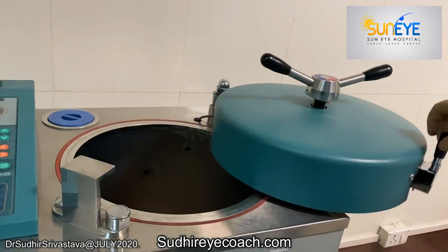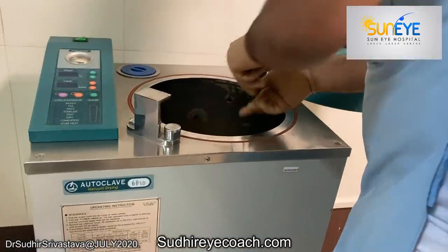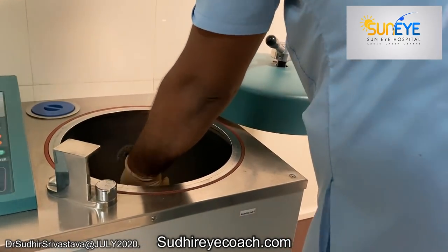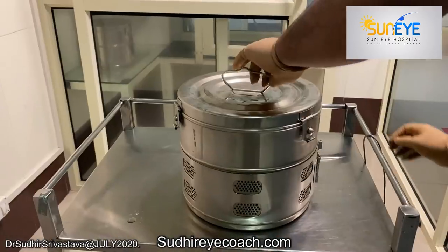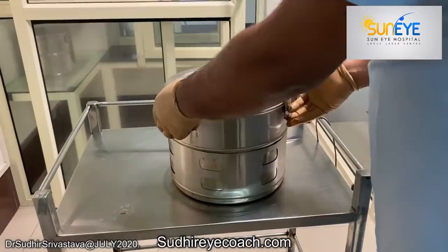It is very simple. Keep the daily Bowie-Dick test sheet at the bottom of the sterilizer and try to keep the level side up. It should be done daily, and we have to run a cycle of 130 to 134 degrees centigrade for a 5-minute cycle. The whole process takes around 35 to 40 minutes.